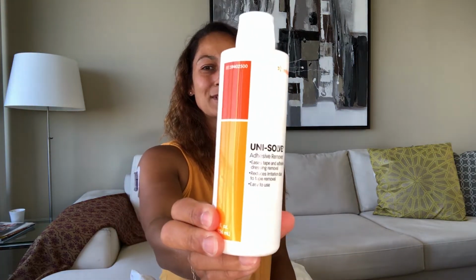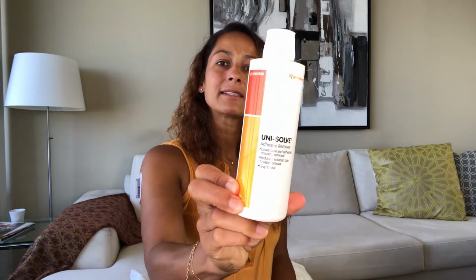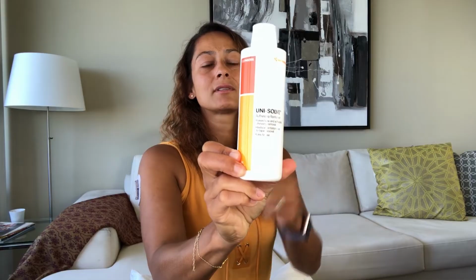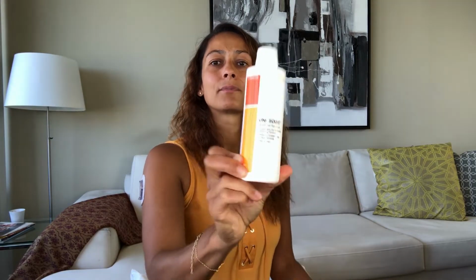Today I'm going to show you how to remove your Dexcom sensor easy, pain-free, and without peeling off anything but just that sensor. So my trick is to use a glue remover, and I promise you it works. So this is a glue remover I'm using currently. Okay, it's a liquid. There are other brands out there, but this is the one I use and the one I know that works. So I'll leave you the name and where to get it below.